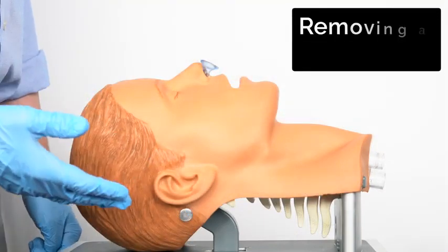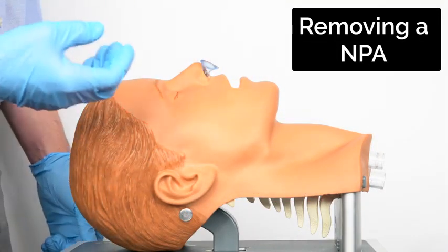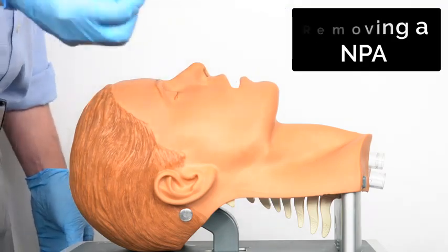When it comes to removing these, because they're so well tolerated, the patient may well be sat up and talking and be able to take it out themselves. If they are unable to, or they want you to do it, it's literally a question of just pulling on the flange and it will come out very easily.